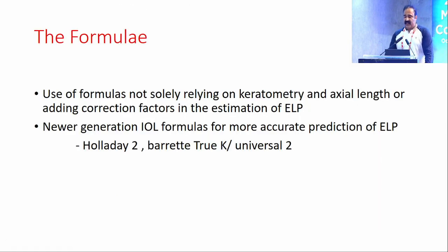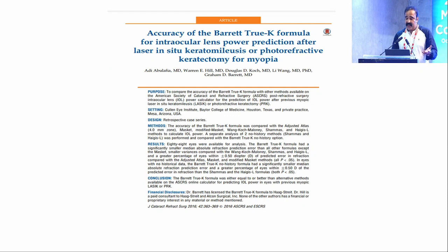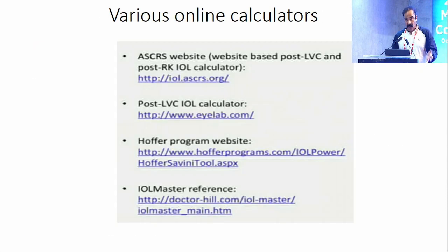The newer generation formulas include Holladay 2, Barrett True-K, Universal 2, and so on. When you ask prolific surgeons who are doing a lot of cataract surgeries post refractive surgery, many actually use the TK from IOL Master or Pentacam and do the IOL power calculation, and they're getting pretty accurate results. All these studies have shown that it works.